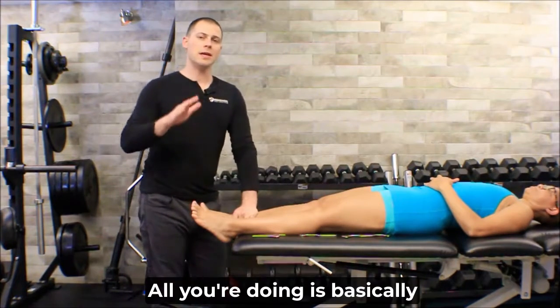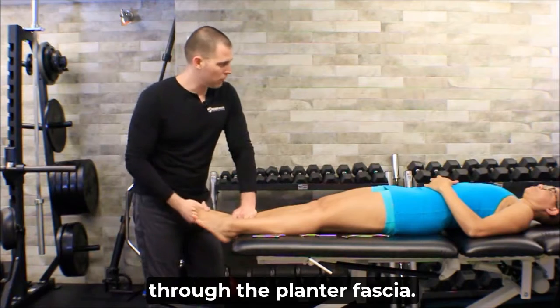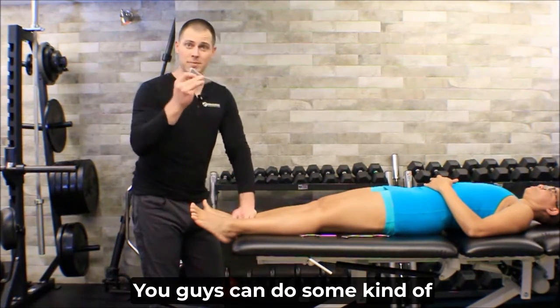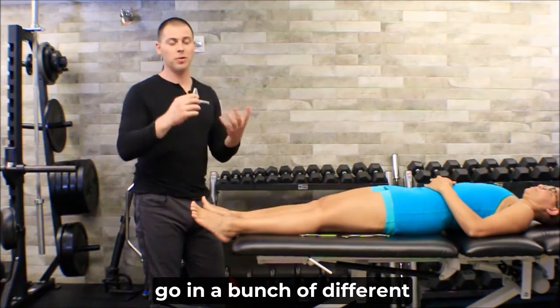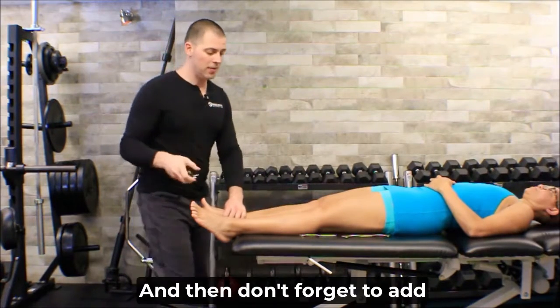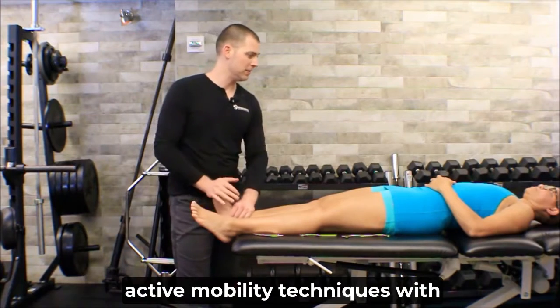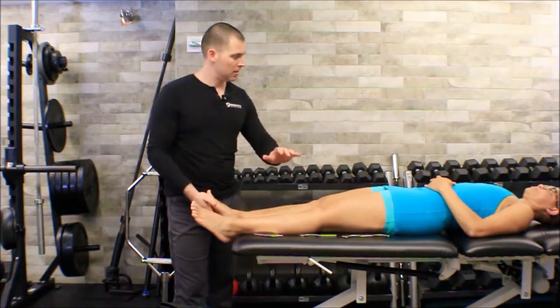All you're doing is basically going through nice long strokes through the plantar fascia. You guys can do some kind of cross friction with this tool. It is going to be very hard to go in a bunch of different directions, but we can get some with the cross friction. And then don't forget to add a little bit of these more active mobility techniques, like the pin and stretch.